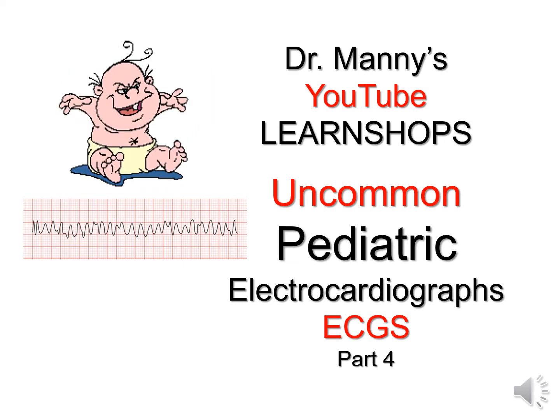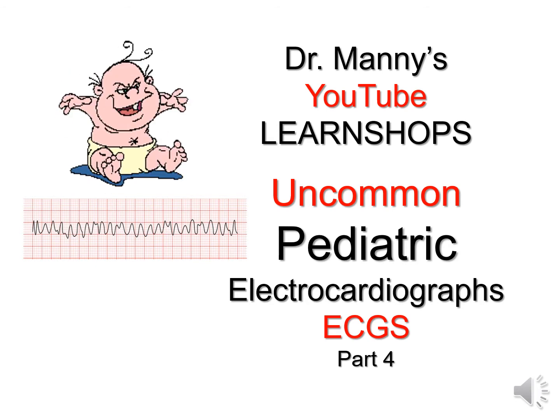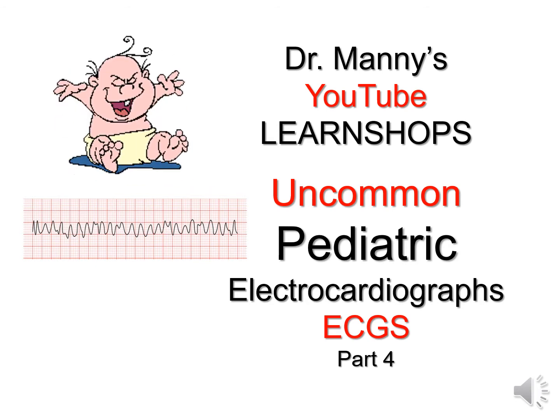Hi everybody, welcome to the final component of the Pediatric ECGs. This is part 4, where we'll be looking at uncommon Pediatric ECGs, as previously we looked at common issues related to Pediatric ECG interpretation.